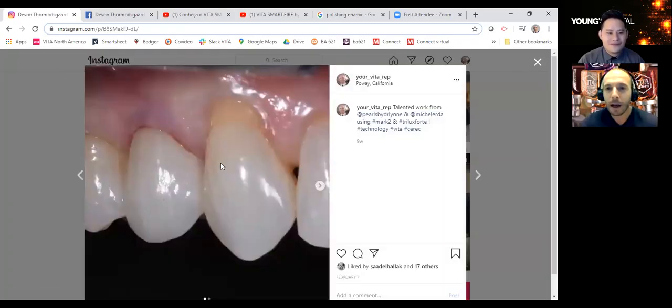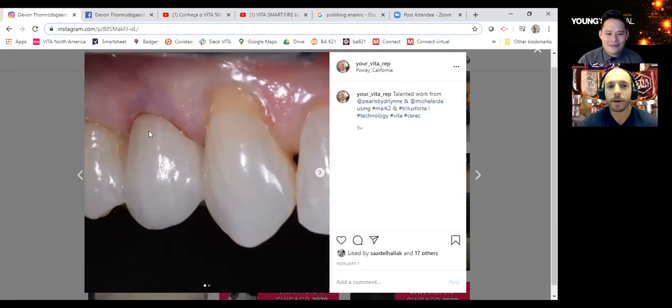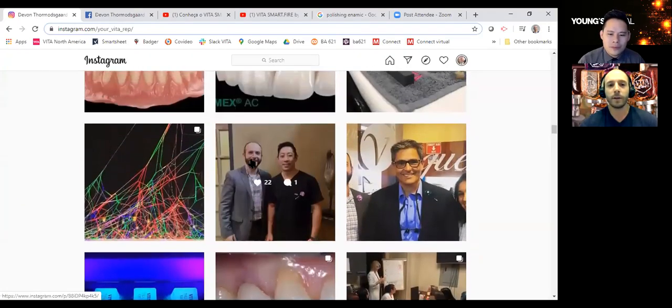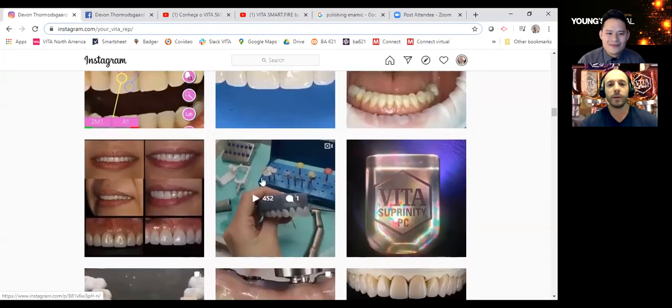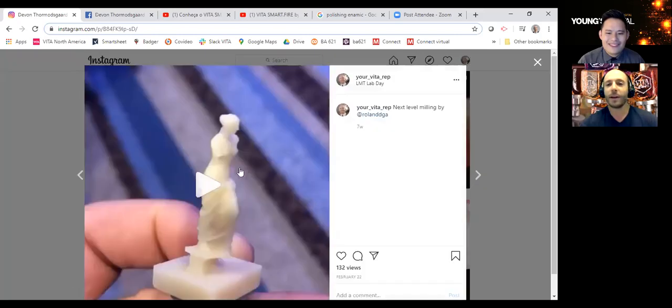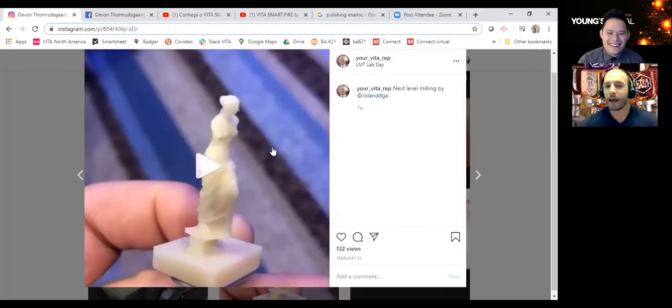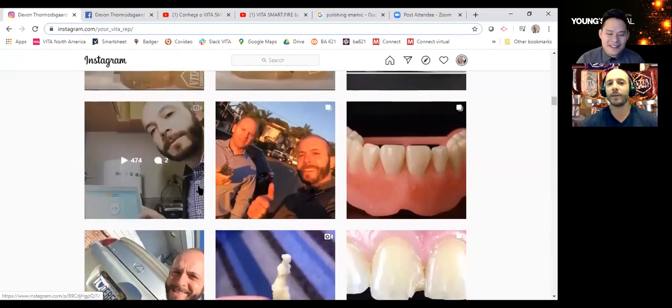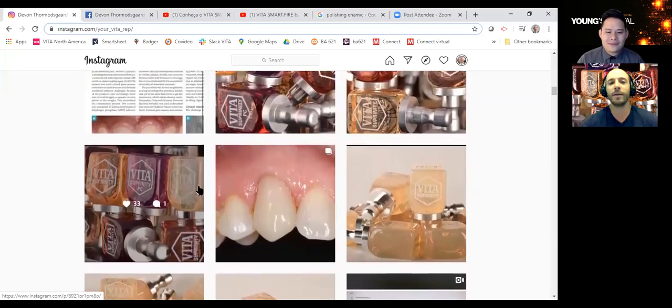This is a Mark II case from Lynn Thomas in Poway, California. She built in these striation marks using some white to match the opposing tooth — a beautiful aesthetic result. Fernando with Roland milled this out of Enamic on a Roland machine — that machine's incredible. I'm so impressed with how much he and his team know about their materials.